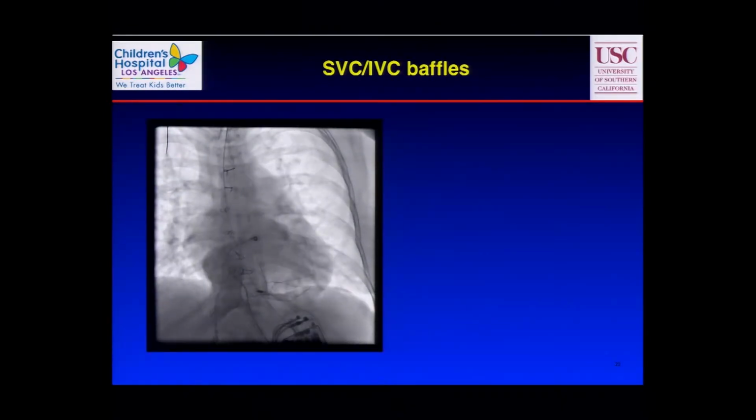Now I know the adult world uses echo all the time, and we always wonder why they need the echo machine for that. But obviously, if you don't do it frequently, you really want some extra imaging help. So again, in the days of the Mustards where there's obstruction, the transeptal procedure is not as simple as going through the native septum.